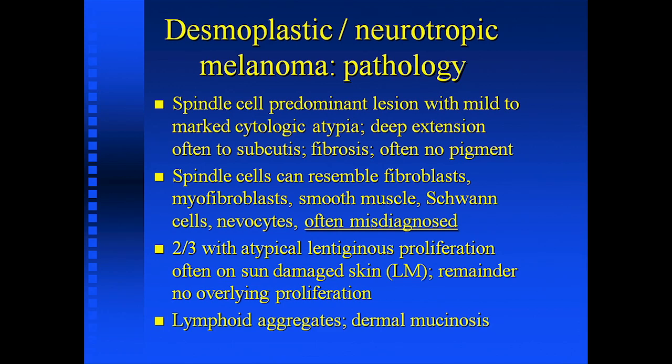There was this one pathologist I knew that ordered S100 stains on everything. And I realized that probably the reason he did that, he missed a desmoplastic melanoma, because that is the stain that you use. Fortunately, in some, and the extent of this varies according to the study you look at, it can be from a few percent to as high as 80%, but approximately 2/3 have something in the epidermis which gives the clue that, in fact, this is a melanoma.